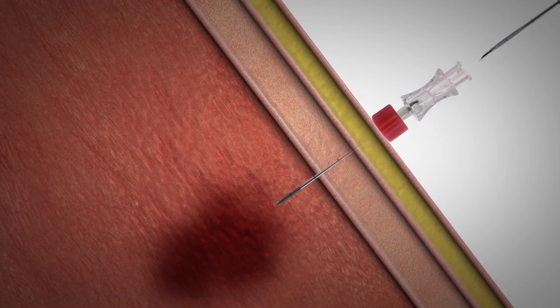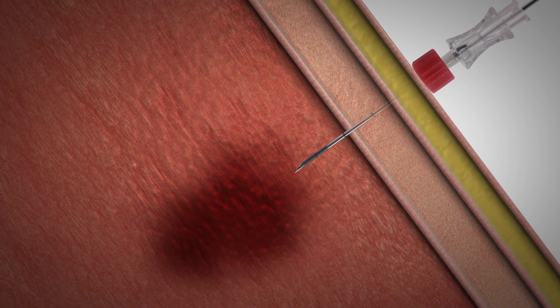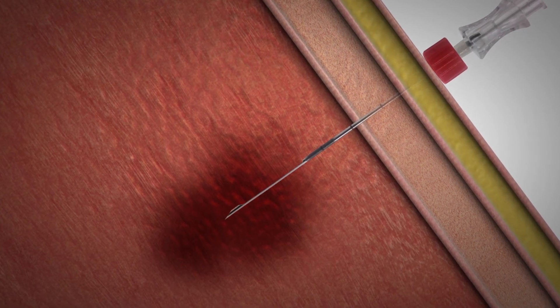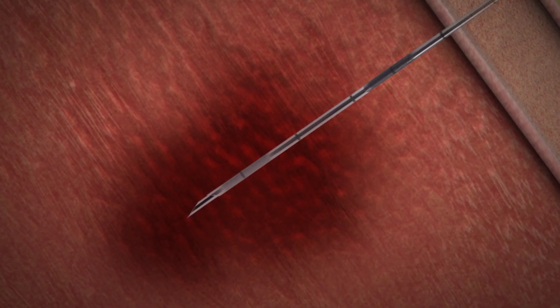Fully insert the loaded MedOne into the coaxial needle and activate MedOne by pressing the preferred trigger button.